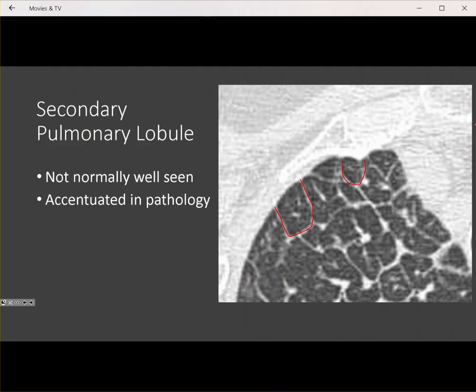In the center of the secondary pulmonary lobule you see this bright structure — this is the artery. The airway you can't see because airways are typically not seen this far out; they're too small to be resolved by CT. The only time you can see an airway this far out is when it's abnormal — abnormally thickened or enlarged — that would be bronchiectasis or bronchioloectasis for the smaller airways. On the periphery of the secondary pulmonary lobule you can see the pulmonary vein. Again, we're not going to see the lobule well unless it's accentuated by pathology.